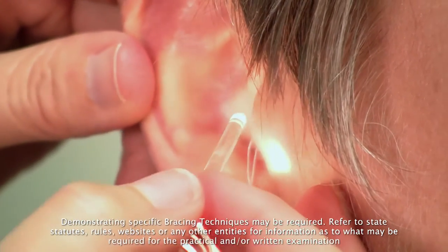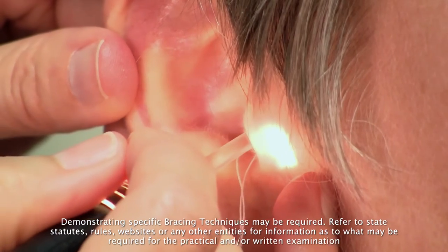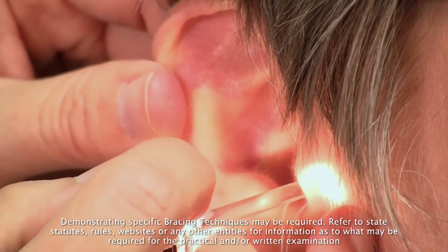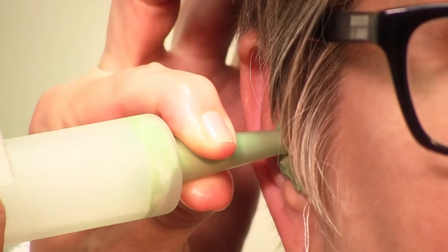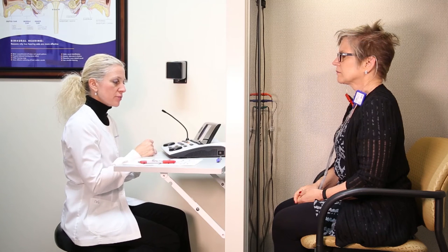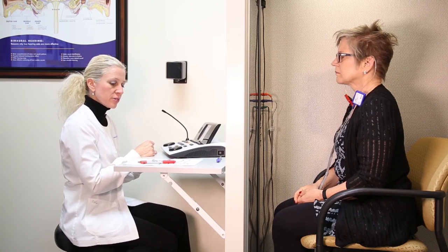I will brace and gently begin to push the oto block into the ear canal. Moving it up to the helix and the helix curl. And we will indicate our score here. Let's re-establish our level of masking in the non-test ear.